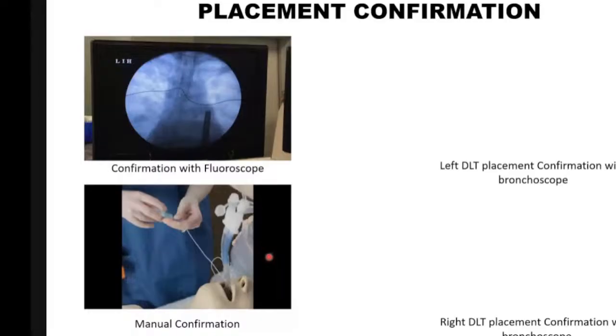Now coming to more, that is the placement with the bronchoscope.